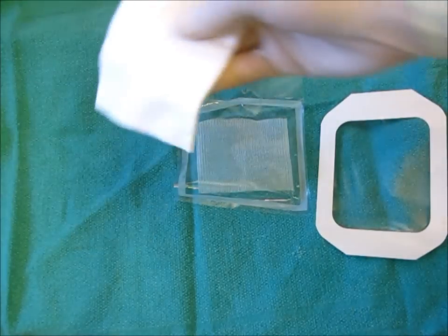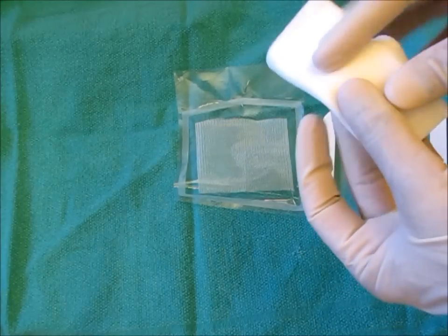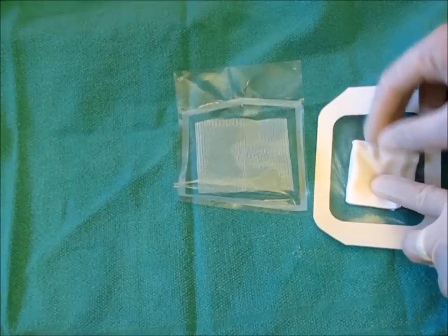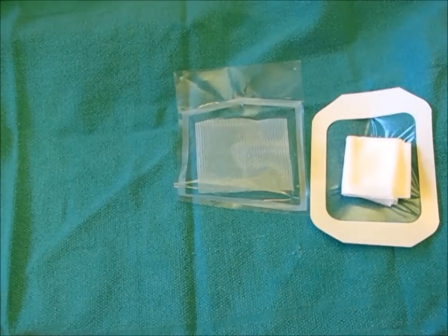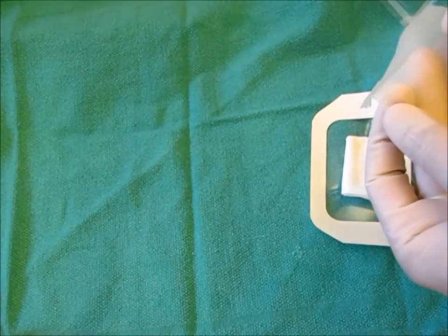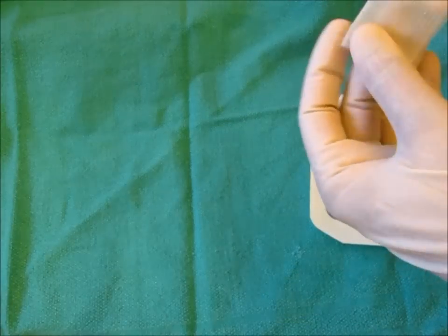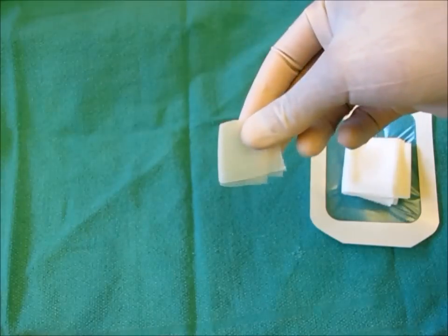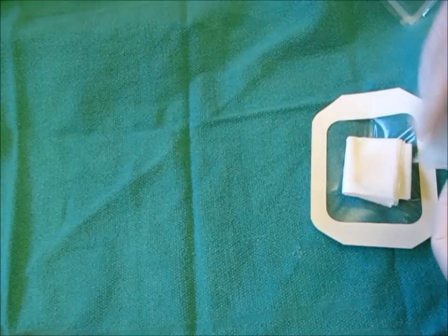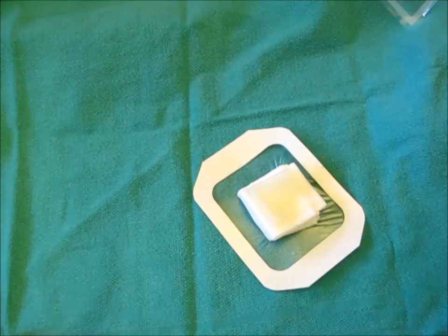First, take the regular gauze and fold it into a 1 inch by 1 inch square. Place it directly in the center of the Tegaderm. Then, again forming a 1 inch by 1 inch square, fold the Vaseline gauze and place it on top of the regular gauze. You have now created your occlusive dressing.